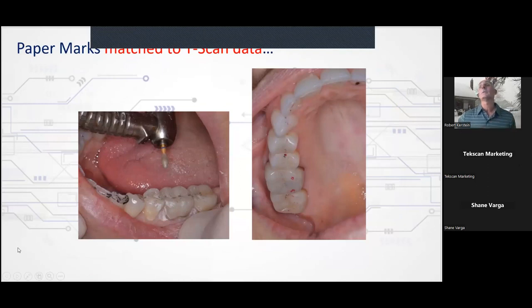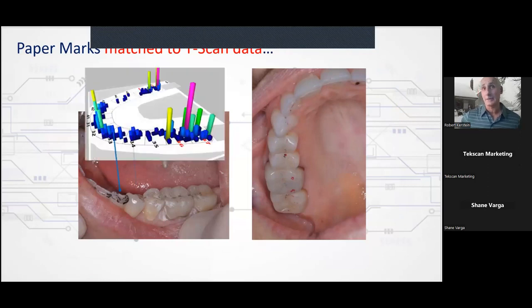Now, what does it really mean clinically? Well, it means that when you are treating someone, you need to be able to do this kind of thing, right? You need to be able to see correctly what each mark means. One of the principles that is often taught in occlusion is you should make all the articulating paper marks the same size.